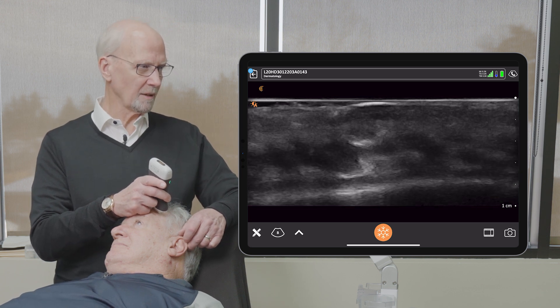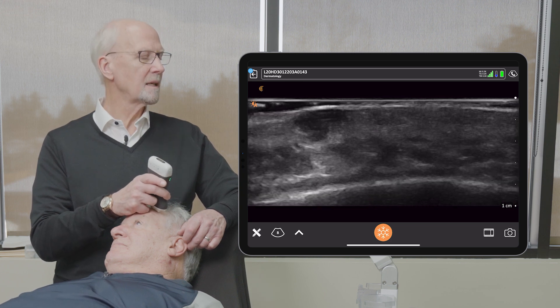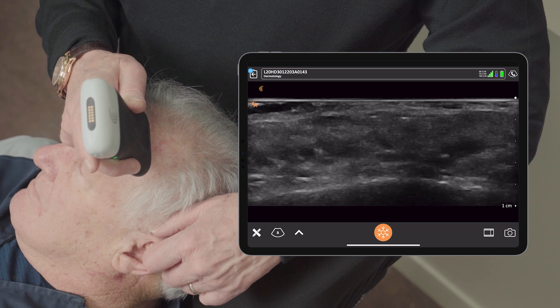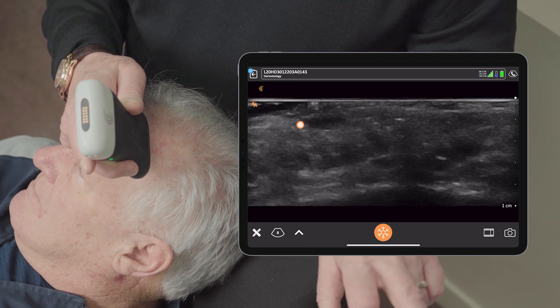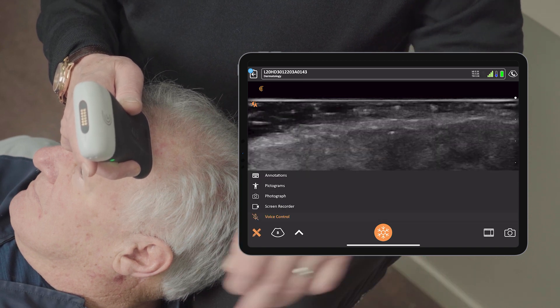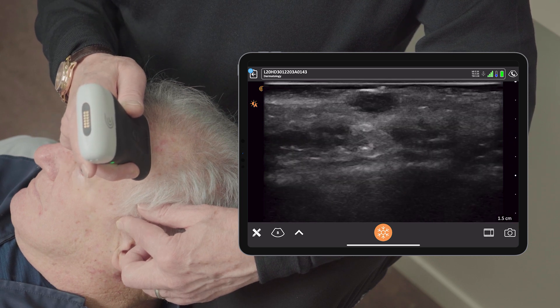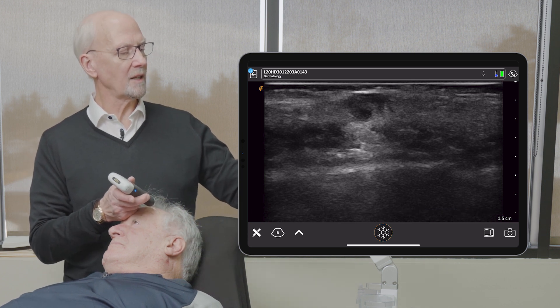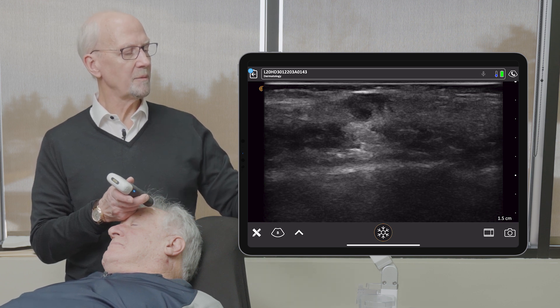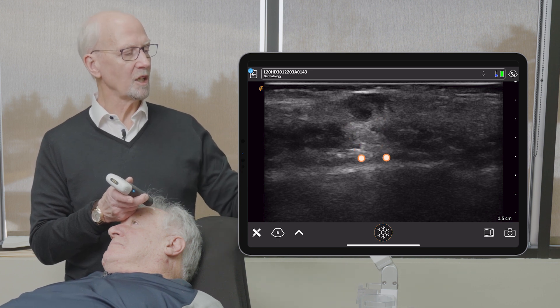And here's our lesion right here. So let's see what we can see. We see a nodule in the skin. We can see in our image that we have a lesion which is taking up most of the space of the dermis. We can see below it some posterior enhancement, so it's probably a little bit cystic.